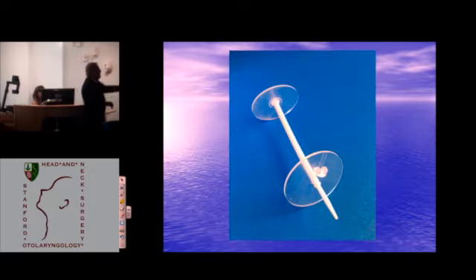I'm in the process, and this is going to be rolled out within the next couple of weeks, as a biflange silicone fistula device. Dan Deschler is going to be here tomorrow. If you see Dan, ask him about his patient. He's got a lady, and it's not the indication for this device. This device is for fistulas in the neck, not punctures, but people are going to use it there. He's got somebody with a fistula about 2 centimeters down the posterior tracheal wall, and he's on, I think, his fifth or sixth prosthesis because it curls over 2 years. This lady's on a normal diet, has no leakage, but she's not healing, but she's also eating normally. So he might give you some thoughts on this.